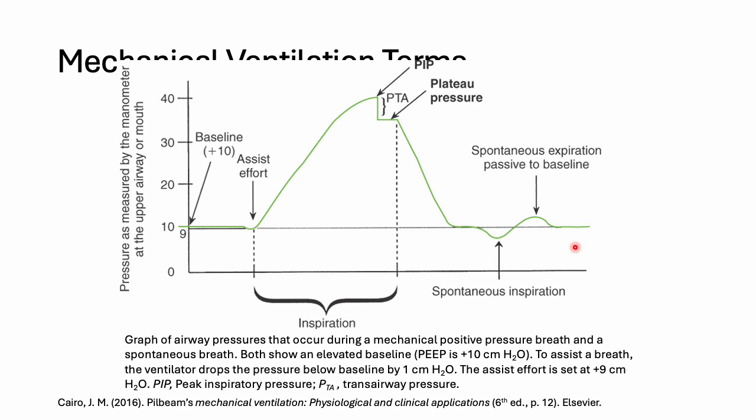So will people be put on mechanical ventilation and allowed to just breathe on a raised baseline and then breathe spontaneously? Yes. That is called CPAP, and we will discuss that in the second part of this lecture.